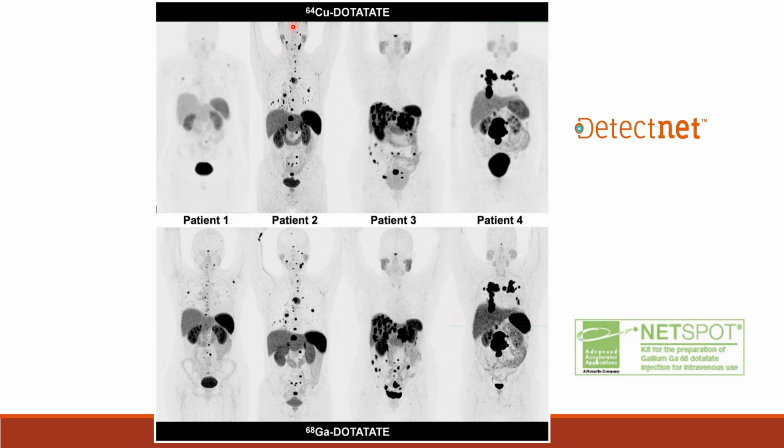Look at the face, the chest. Look over here just above the liver. Look over here on the right side, especially. Even in the axilla area, you see more spots, and the spots that you see are showing up darker.